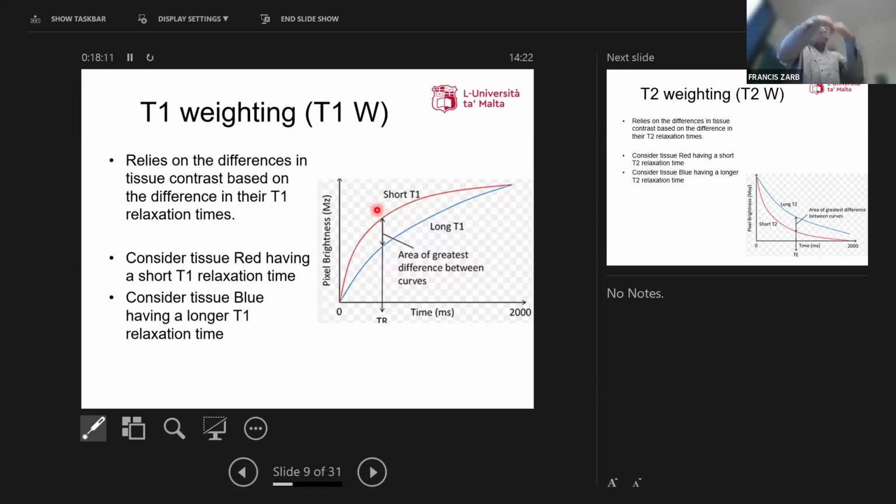So I want to repeat before they reach that signal intensity. I repeat, and therefore the TR is shorter. Okay, so I'm going to get the signal somewhere here, but I don't want the TR to be there because by the end of the sequence, both of them would have reached the same. So I still want to have that discrepancy, that variation between signal intensity.